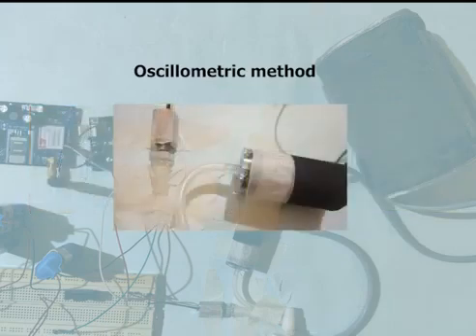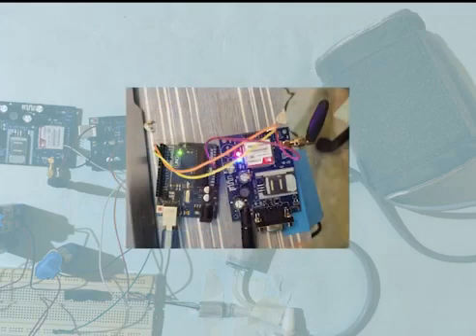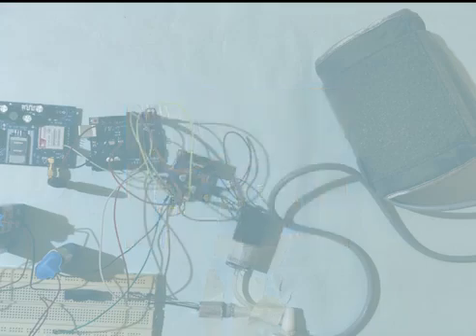To control the mechanism of inflation and deflation of cuff, we use an air pump and solenoid valve, respectively. For data transfer, we make use of a GSM or a 2G network which transmits data on the cloud using a GSM module for Arduino, which is called as SIM900A. This completes our hardware model.